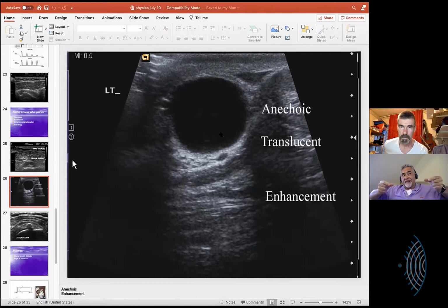And so the slice thickness, will it ever get to a level of thinness to where it won't be a drum you're still beating? I think probably yes. We're certainly hopeful for that. With the ability to focus it more effectively, it will become less of an issue.